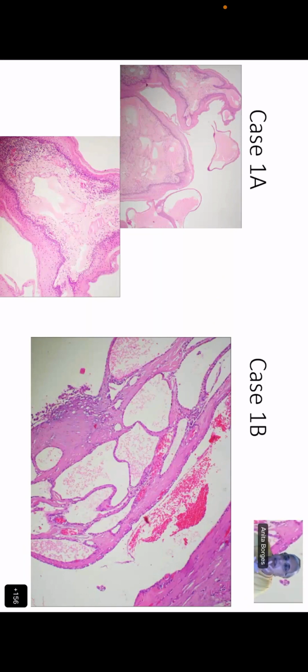So if I see this thick thing in the thyroid follicles, I cannot call it a secretion. Or if I see it in the glands of the skin, for instance, or anywhere, I can't call those things secretions. And while describing, what is a secretion?